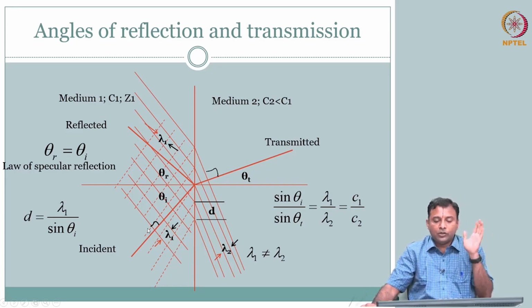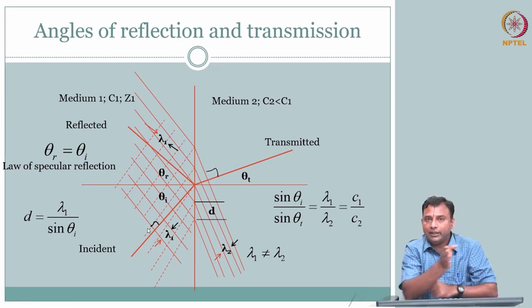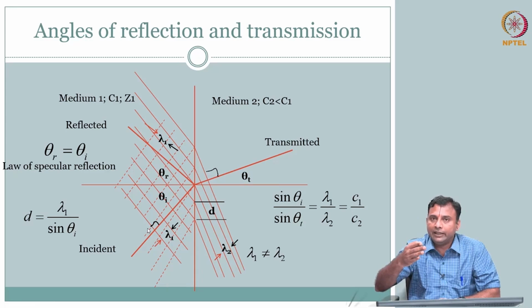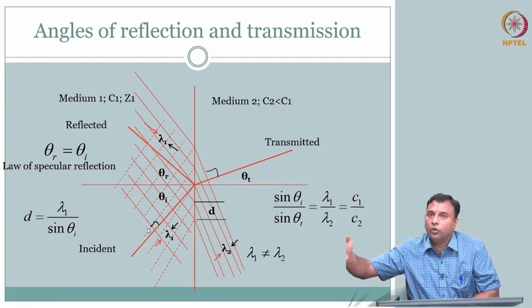So your lambda, so when it is going like this, I have an interface, it is hitting the interface, coming back in the same medium, and some of it is going forward.